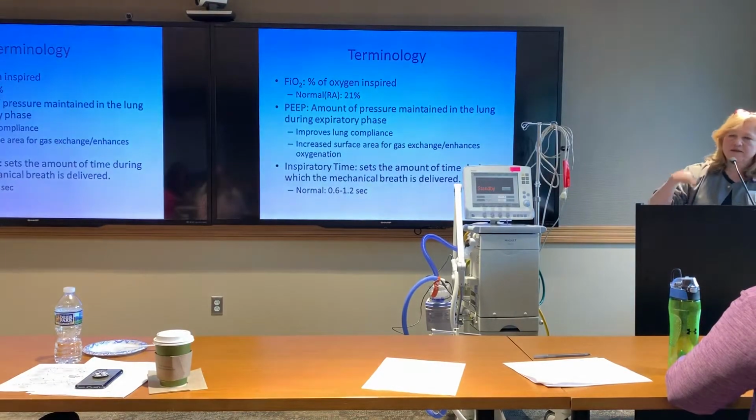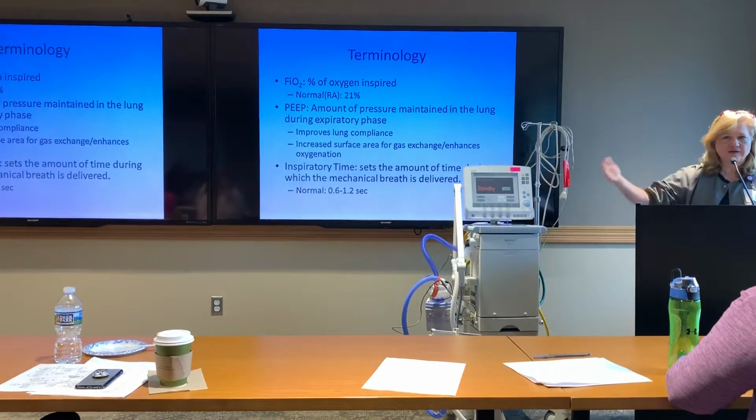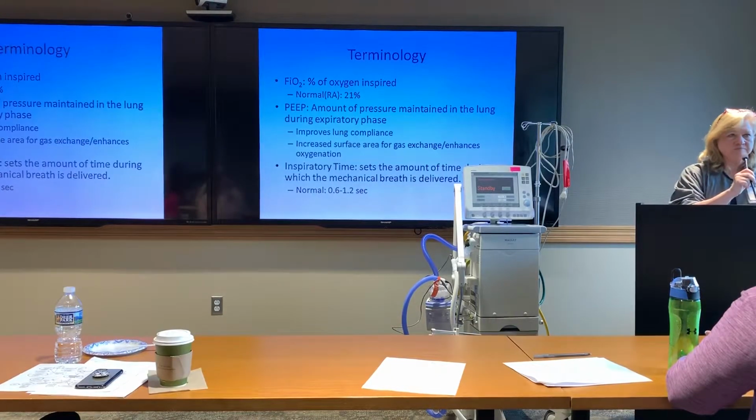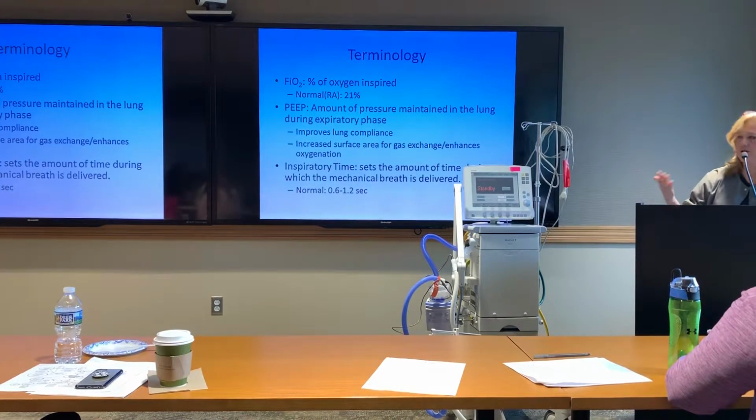There's a slide a little bit later where I talk about how we have 3 words that all basically mean the same thing. It just depends on how we're ventilating the person, whether we call it EPAP, PEEP, or CPAP. They all mean baseline pressure. We just use terminology differently to keep our jobs. That's not true. We use the terminology differently because there's different degrees of ventilation, but I'll explain that to you later.